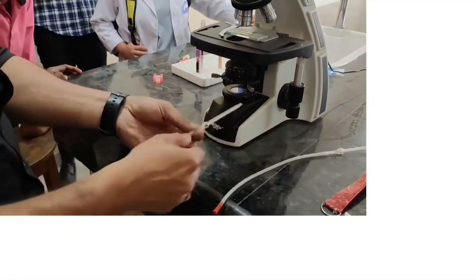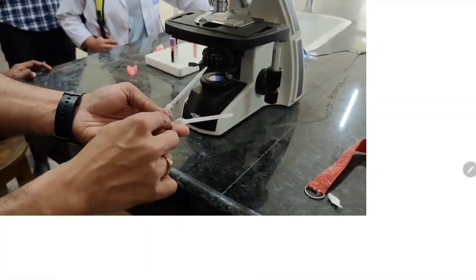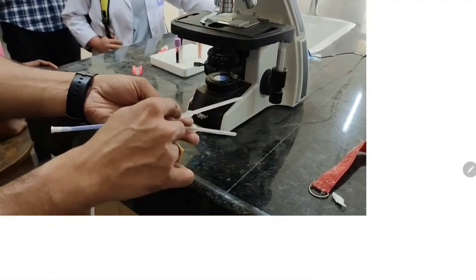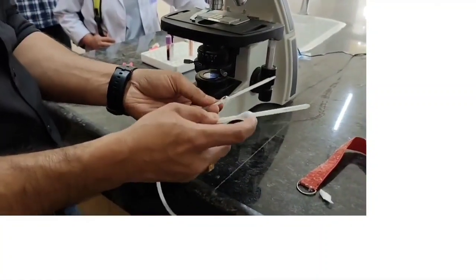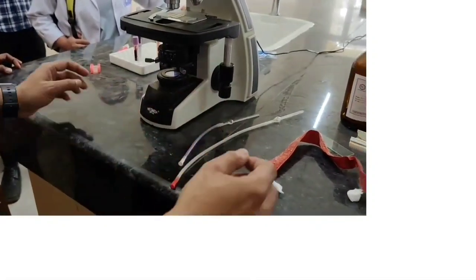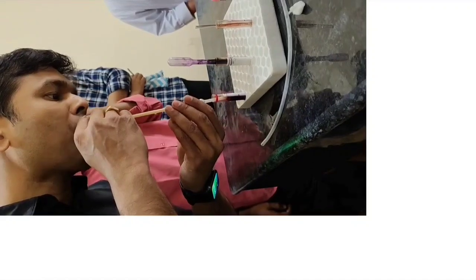Now let's see. Okay, this is the WBC pipette and this is the RBC pipette. We can see markings are not clear, but the RBC pipette has a red bead and the WBC pipette has a white bead and white mouthpiece. And the bulb size is comparatively smaller in case of WBC and bigger in RBC. So let's start the test properly. Now let's start with the blood. This is the RBC pipette and we are drawing the blood.